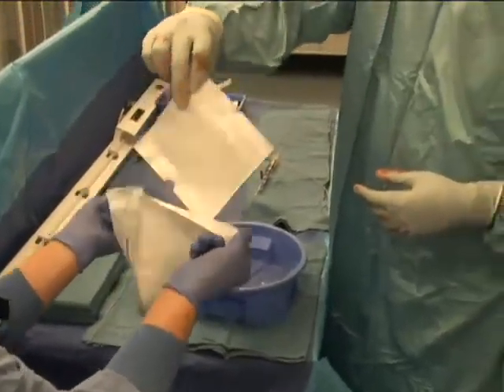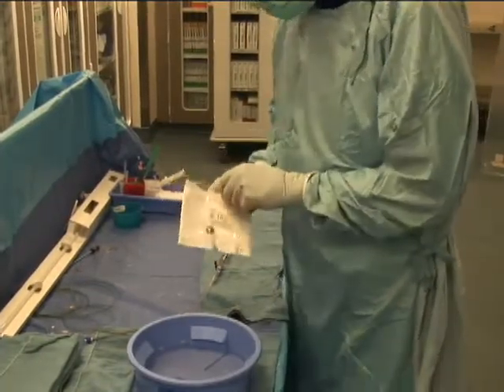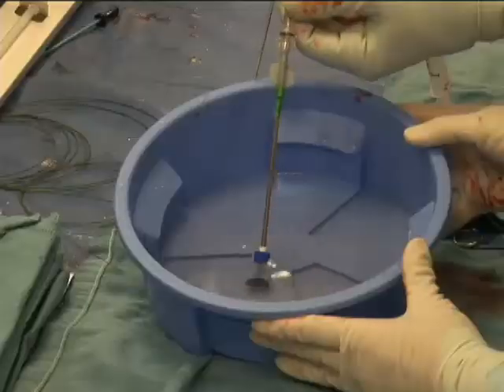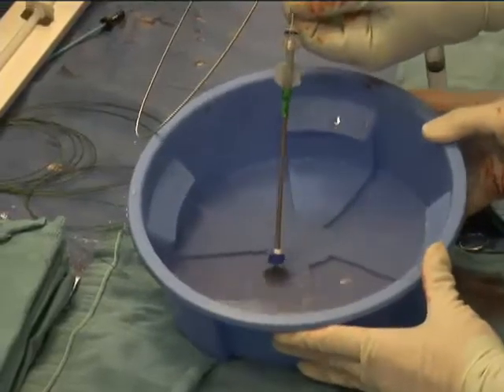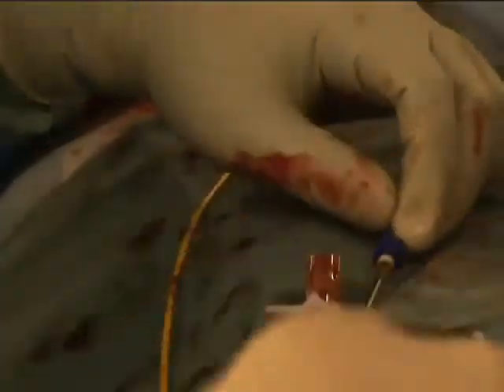Based on these measurements, the specific device and device size appropriate for this patient is chosen, prepared, and attached to the delivery system. The device is submerged in saline and pulled into the delivery catheter before insertion. The delivery catheter is now inserted into the delivery sheath.